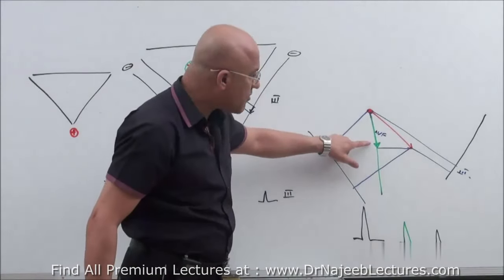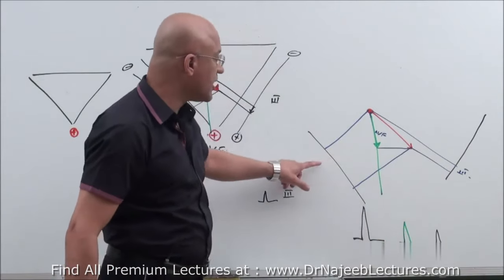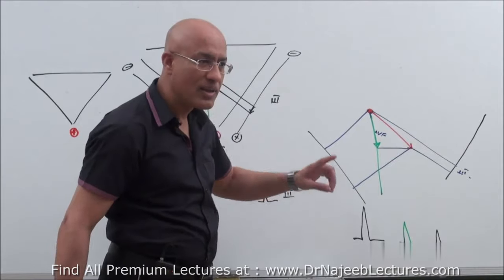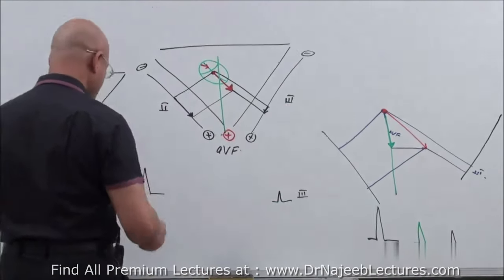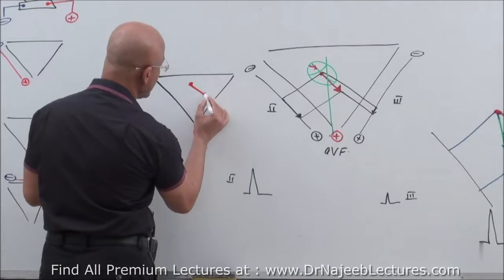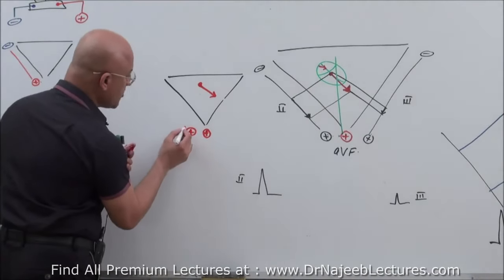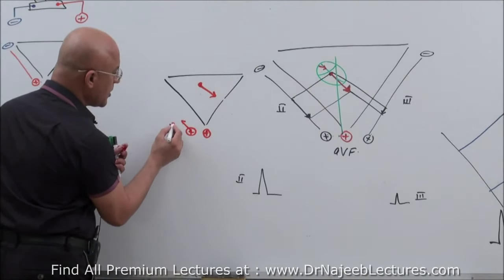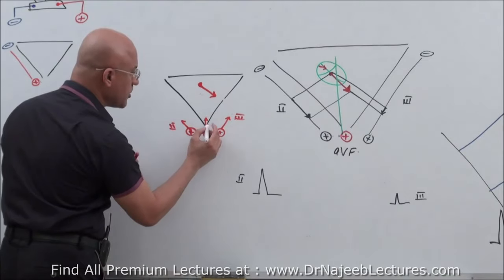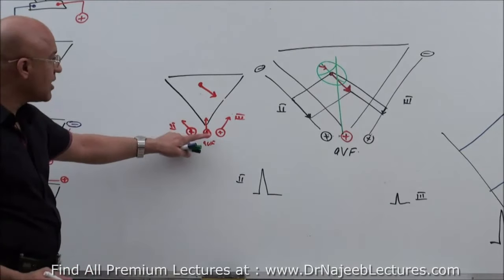So what is happening? The AVF wave pattern is somewhat similar to lead number 2 and 3. Is that right? Now we come to another thing. This is a major electrical vector in the heart, right? Here I put lead number 2, and here I put lead number 3, and if it is looking straight, it is AVF. All of them are inferiorly located. All of them are looking at the vector.